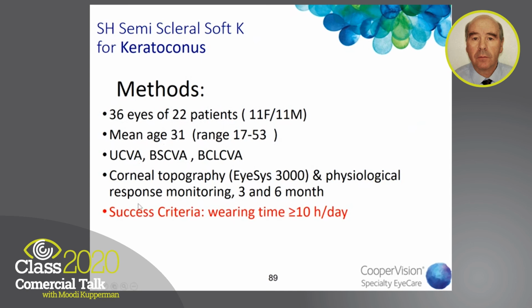The success criteria was wearing time bigger than 10 hours per day. This was the most important issue. Of course, it is related to best correction and physiological response monitoring after 3 and 6 months.